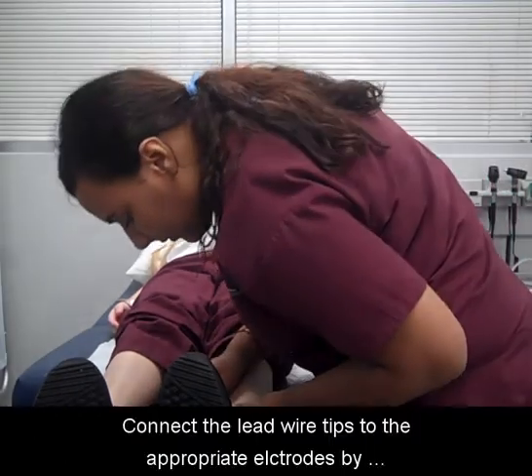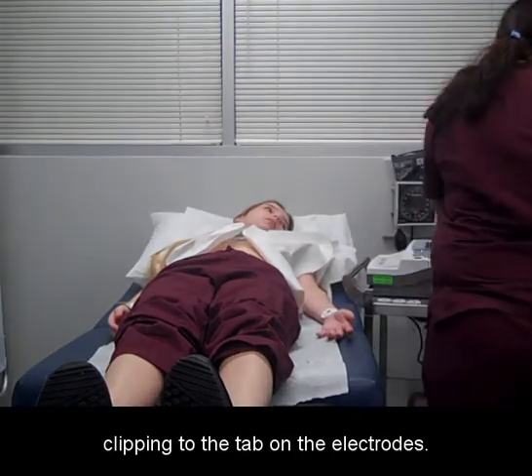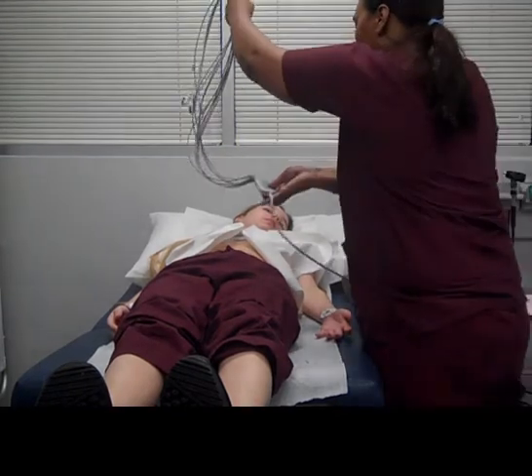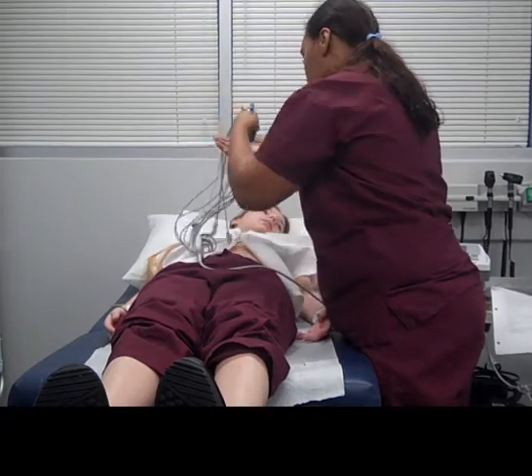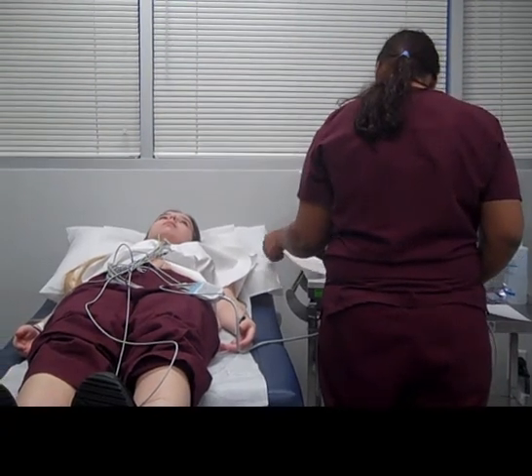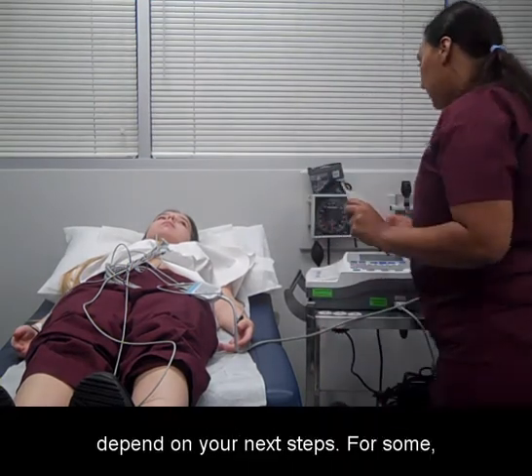Connect the lead wire tips to the appropriate electrodes by clipping to the tab on the electrodes. Once everything is connected properly, press the auto button on your machine. Depending on the type of machine you have will depend on your next steps.